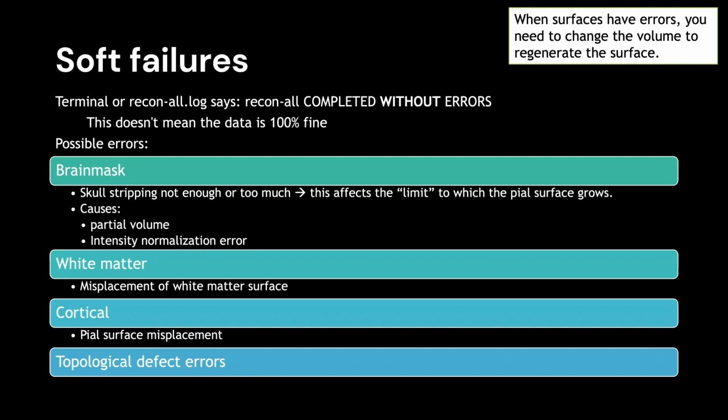Once you check that it says completed without errors, you open the image, and you see there are a couple of errors. The questions that you have to ask yourself are the following. First one, is the brain mask and the skull stripping okay? Was the skull stripping not enough or too much?